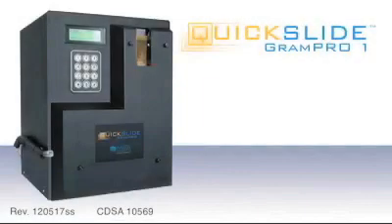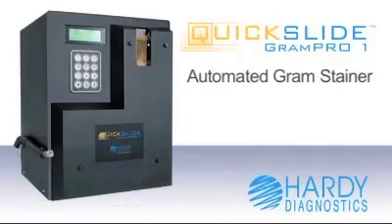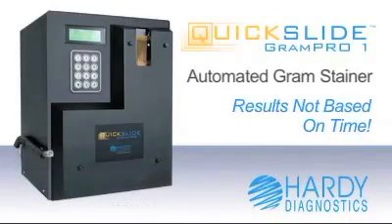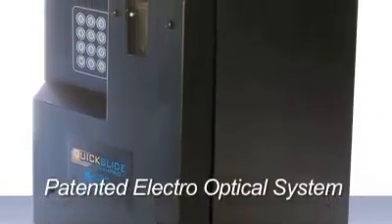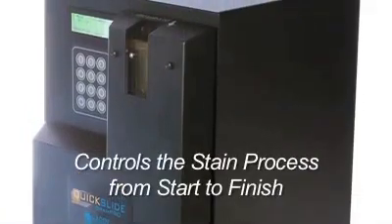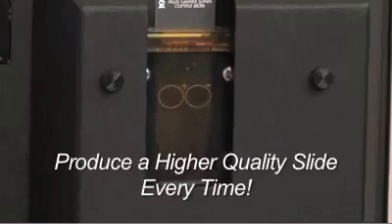The Quick Slide Gram Pro 1 automated Gram Stainer represents the newest technology in the Gram staining field. Now your results are not based on time, such as old-style spray systems. The Gram Pro 1's patented electro-optical system, or electronic eye, controls the stain process from start to finish, to produce higher quality slides every time.